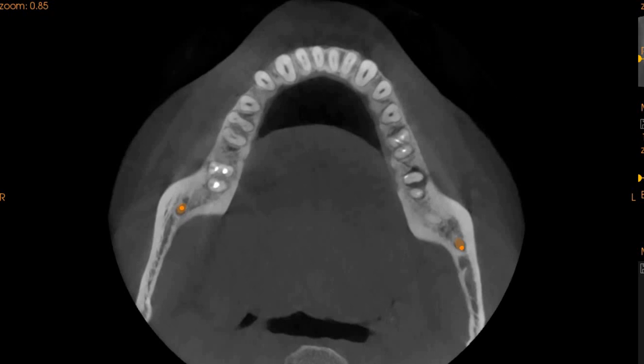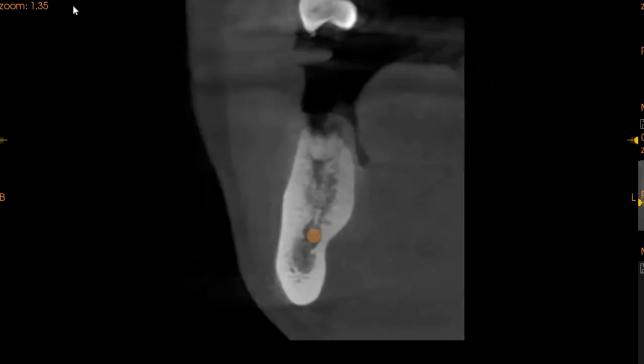Now, our kind doctor has requested a Megagen implant placement, which we will show next. This is the ideal area where, after the extraction of the BDRs of the first molar, we will have adequate bone where implant can be placed interradicularly. At the crest, we will have approximately 9.2 millimeters of width, and we will have approximately 14 millimeters of distance till the inferior alveolar nerve.